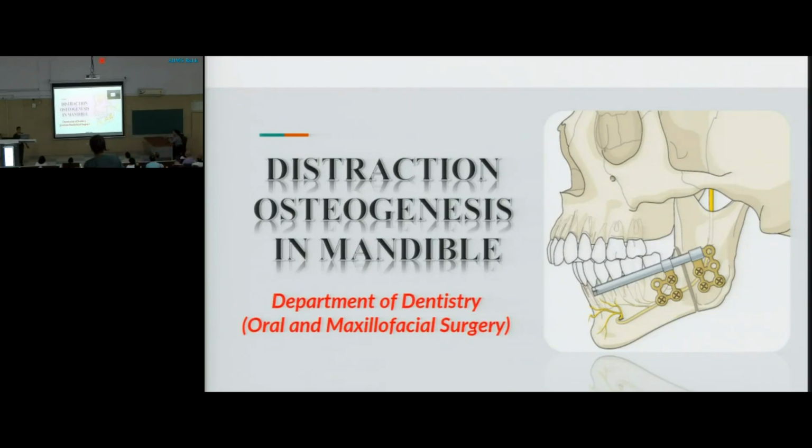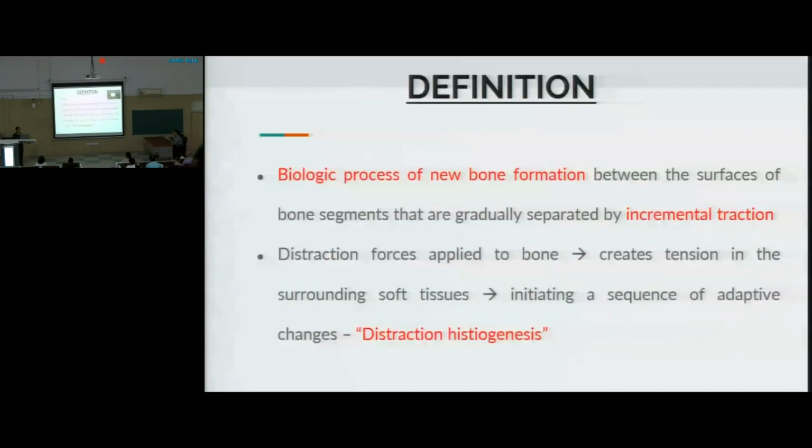I'm going to give a case presentation which was done in our institute, in our department, with distraction osteogenesis of the mandible. Definition, just a brief introduction about the distraction.